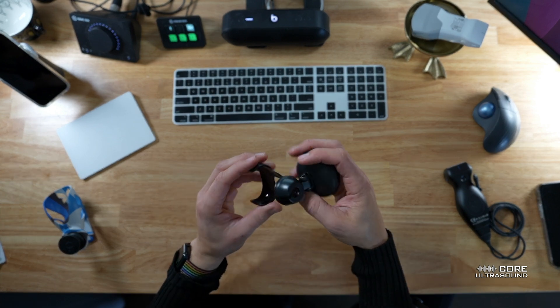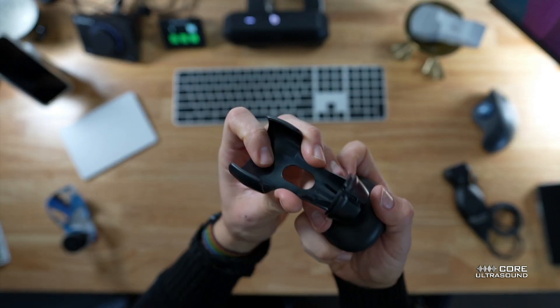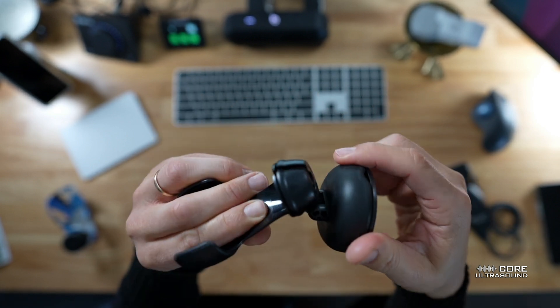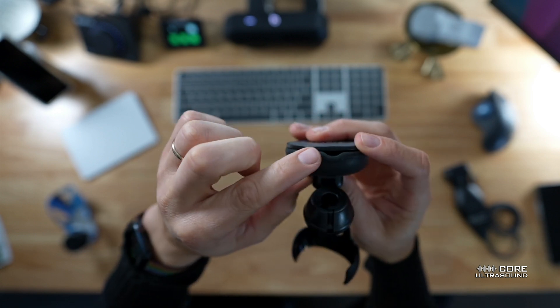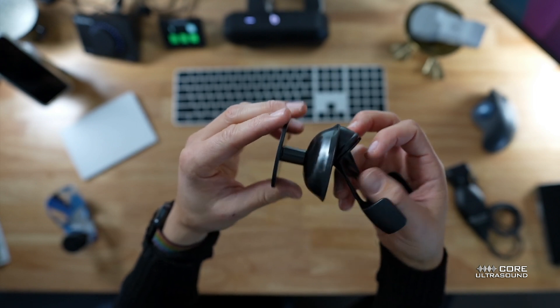And we have our device. First off, it looks pretty sweet. It is fully articulating — this way, that way. All that looks great. Then we have this little bumper here, which is for the cord. We bring this out and that's where the cord goes.